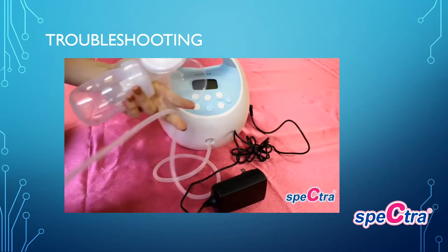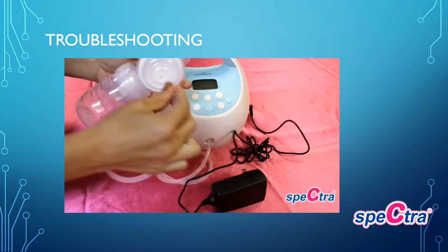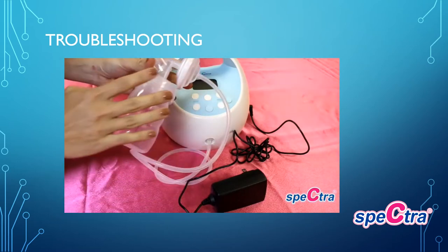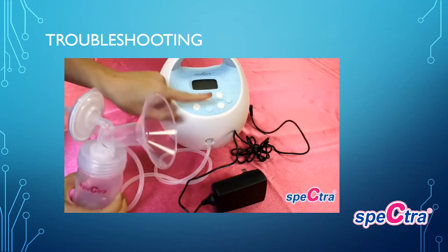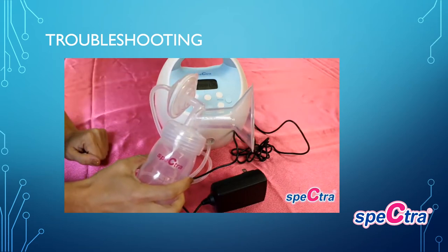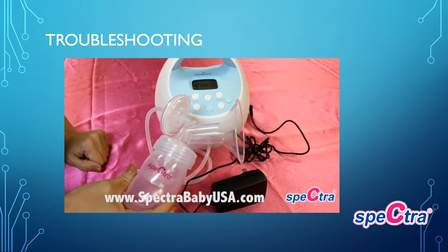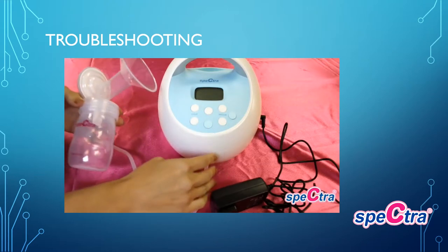Make sure there are no holes in any of the air tubes, as that creates a loss of suction. Once you have double-checked your tubing, backflow protector, and valve to make sure they are properly set up, retry turning on your pump to see if you now have suction at the breast. If not, please contact us at SpectraBabyUSA.com for further warranty information and support.